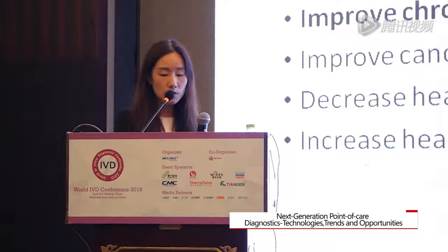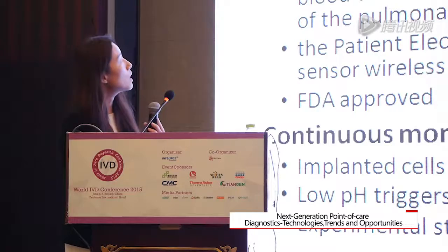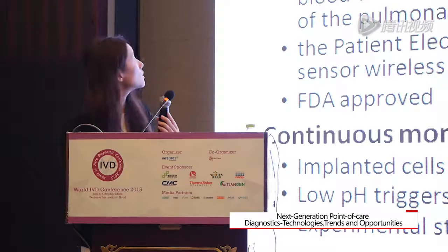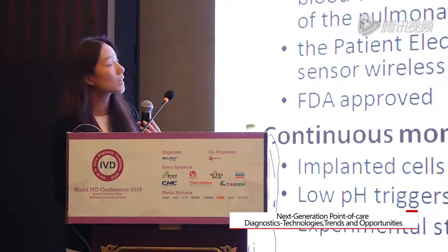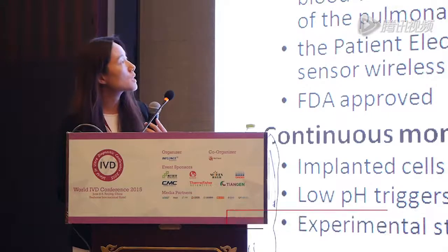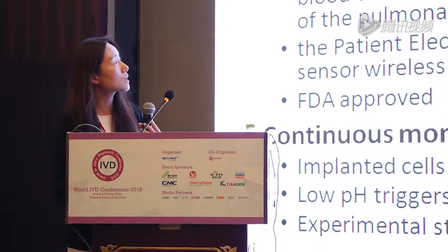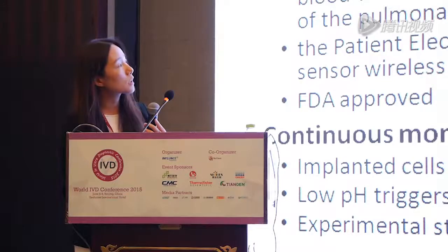Let's go to the next bullet point, which is chronic disease monitoring. Here is a very good example, which has been approved by the US FDA, called the CardioMEMS device, for remote heart failure diagnosis. We know that for patients who have a heart failure history, it's very important to monitor them in real time and frequently so that if the next heart failure comes, the intervention can be done rapidly. Here you can see there is an electronic sensor in the middle of the device, and this is inserted into the patient's pulmonary artery by a very thin catheter or wire conjugated to the wireless electronic sensor.